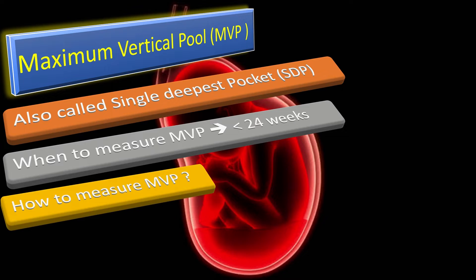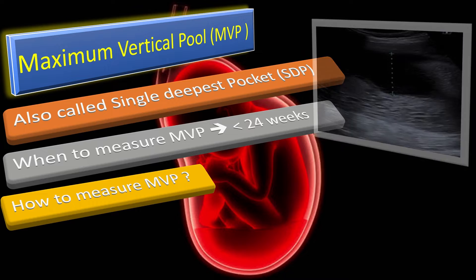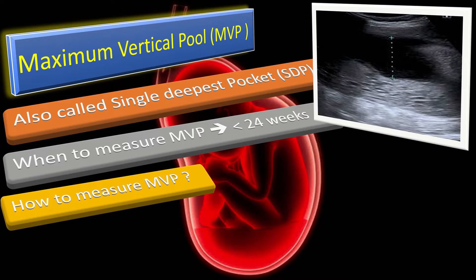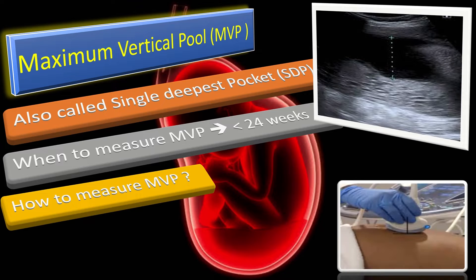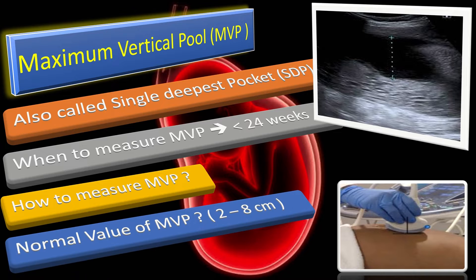To measure the maximum vertical pool, first find the largest pocket of amniotic fluid free of cord and fetal parts. Measure the greatest dimension with the ultrasound transducer perpendicular to the uterus. The normal value of maximum vertical pool is 2 to 8 cm.